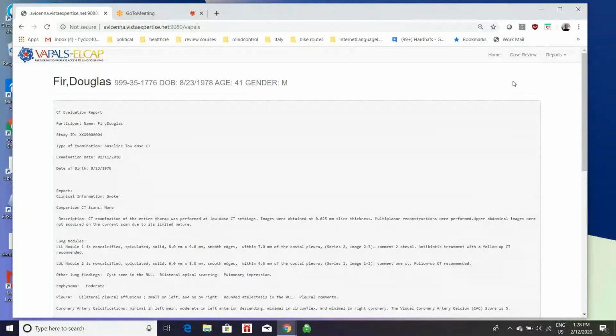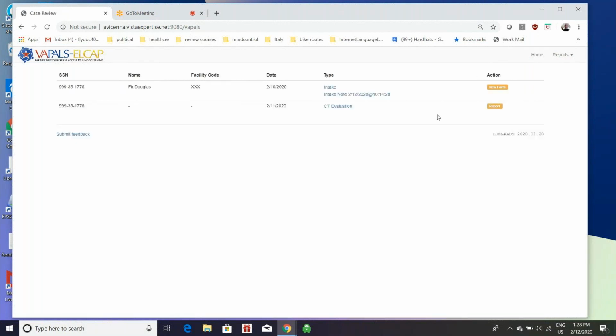Yep. Let me know anything we could do, because we tried to match the formatting in the samples you gave us, and we're trying to provide raw text so that when you copy it and paste it into PowerScribe, it's all ready to go through the PowerScribe templates.